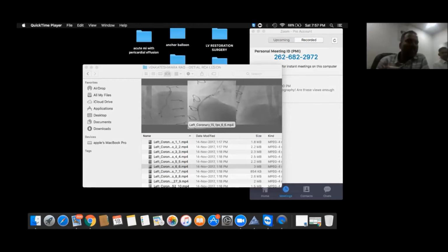That is a longitudinal geographical miss. Geographical miss is the most important factor for restenosis at stent edges. That's why the patient came back. It's not a restenosis, it's a lesion which was missed. That's the reason his symptoms also persisted. So we did an IVUS-guided stenting for this patient and he is asymptomatic. We did it almost 1 year back. The angioplasty was done elsewhere. Within 6 months of angioplasty, he came back with symptoms. Now, we did an IVUS-guided angioplasty.